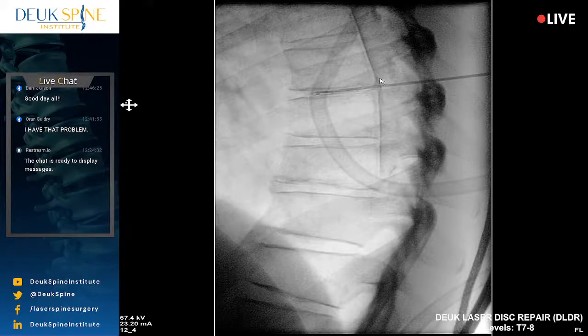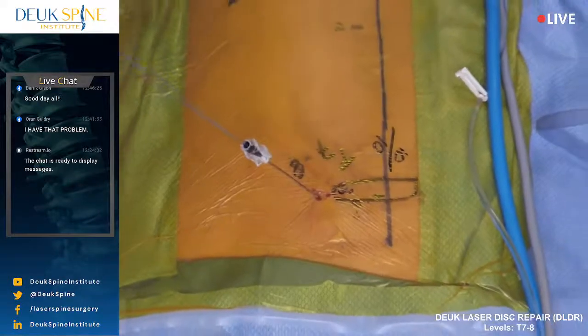But you can see the herniation. Show them the herniation, right where, yep. Circle it for everybody. That's it. It's incredible, that tiny little herniation, almost missed on an MRI. Source of his pain, and it's going to be gone after the surgery. You get to go to sleep now. When you wake up, your surgery will be over, and you'll be very thankful it was done. Count out loud in Australian for me.